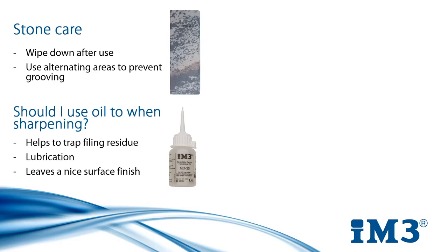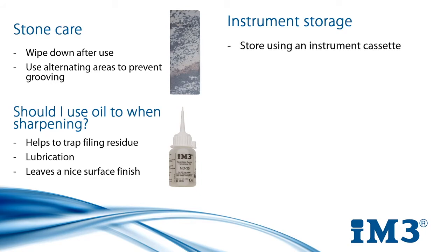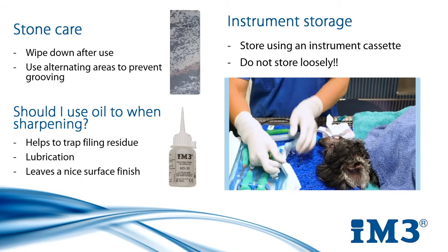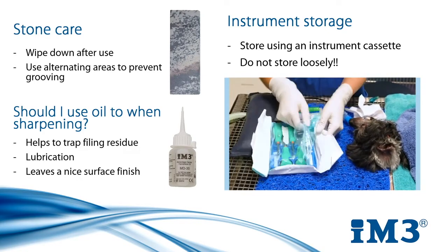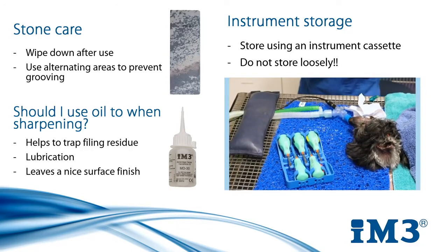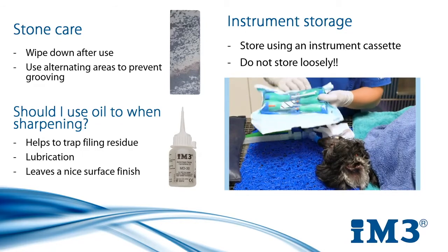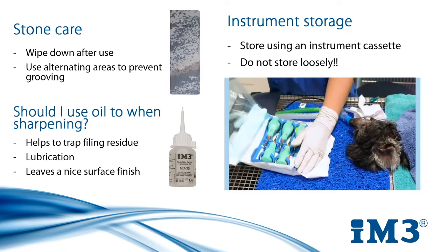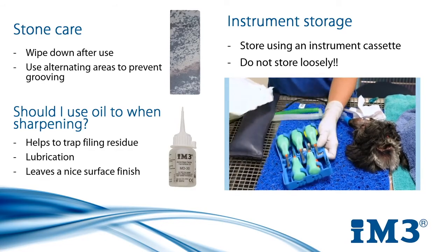Once you've successfully sharpened your instrument you need to keep it sharp until time to use it. This is ideally done by using cassettes. Loosely storing your instruments in a drawer or a box means they will roll around and bang off each other, blunting in the process. A cassette neatly stores them, preserving their sharpness for surgery and making them easier to autoclave as a set. Rubber caps to place over sharp ends do exist, but they can do their own work at blunting the blade as they are placed on and off, similar to putting a needle through the rubber cap of a medicine bottle — it's miniscule but it makes a difference.